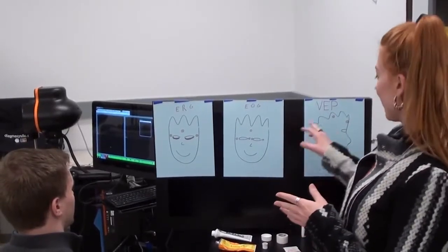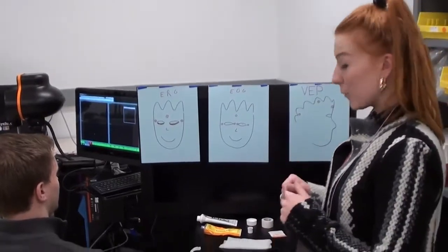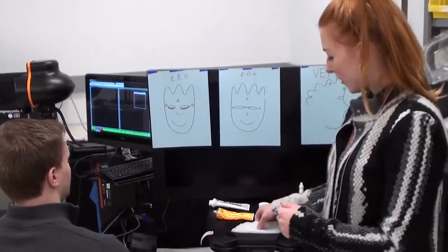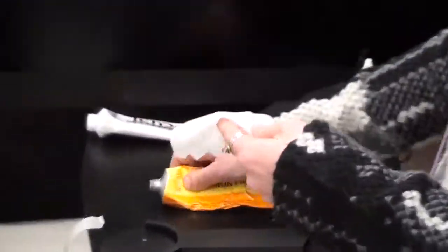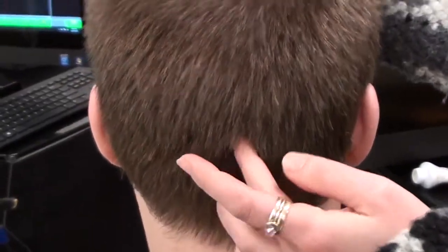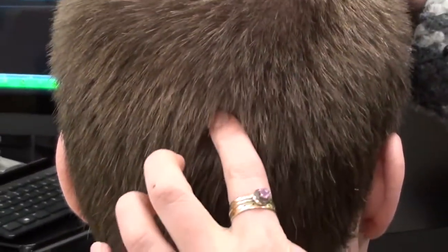When applying the crown and occipital lobe electrode for the VEP, we use the same method as we would for any other skin electrode. We start with lemon prep on a wipe and come over to the back of the head, finding the inion or bony point right around here. We take two centimeters up from the inion and mark our location.